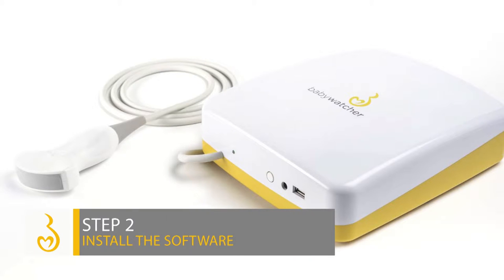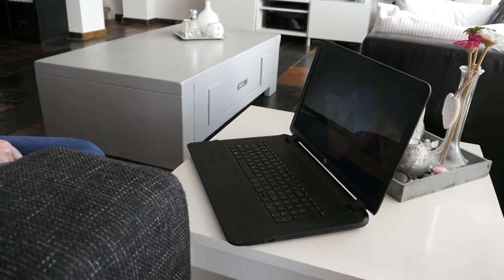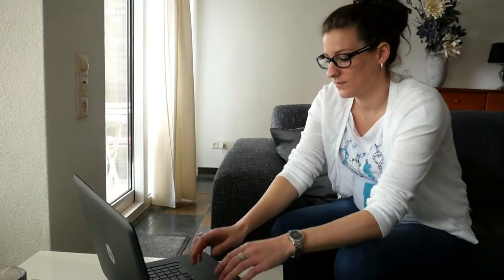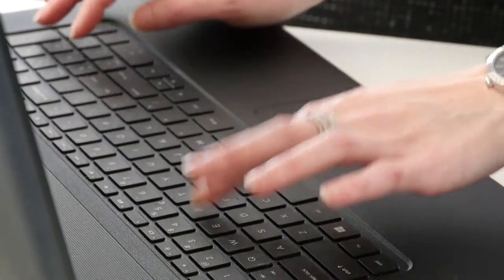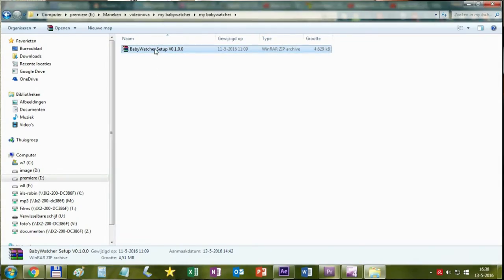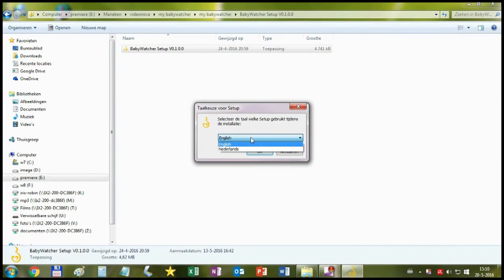Step 2: Install the software. Switch your computer on and log on to your personal Baby Watcher account. Download the software from your account. Double-click on the zip file after the download is complete and the installation will start automatically.